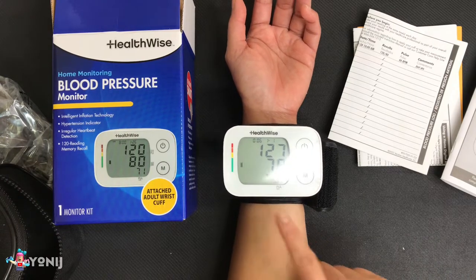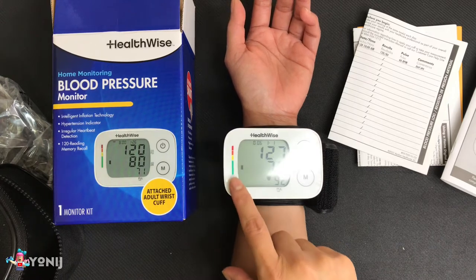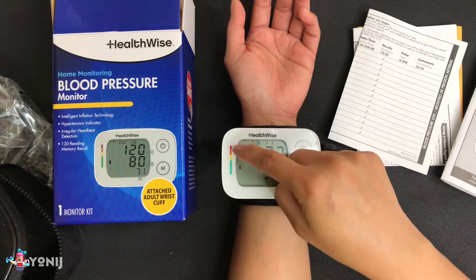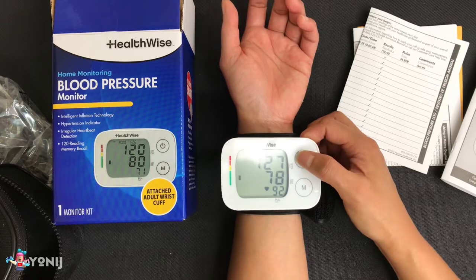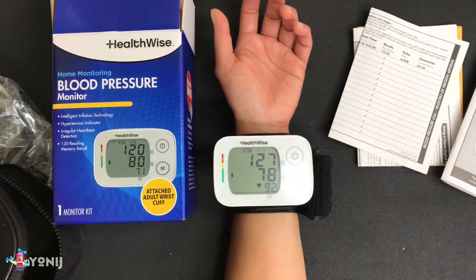Okay, now it's more normal. As you guys can see, this is the level that shows you don't need to worry — a while ago we were on the orange side. So the reading is 127 over 78 with a 92 heartbeat. We're gonna go try again.